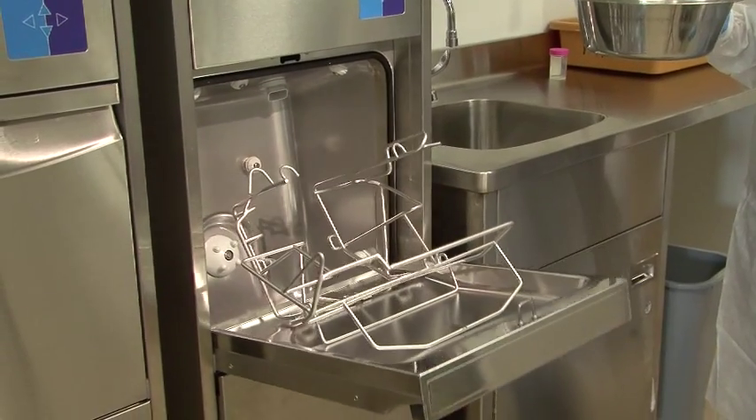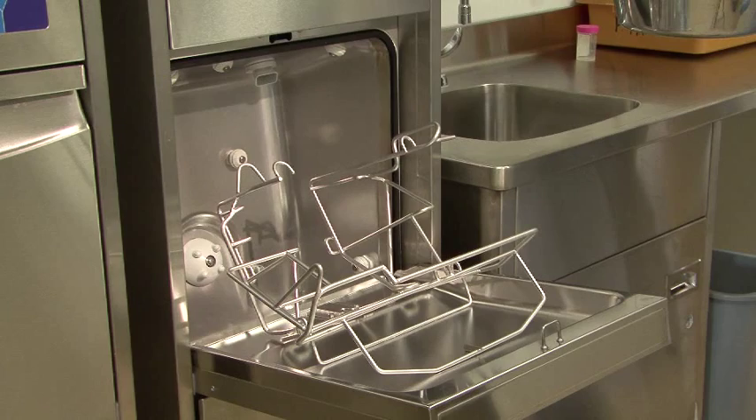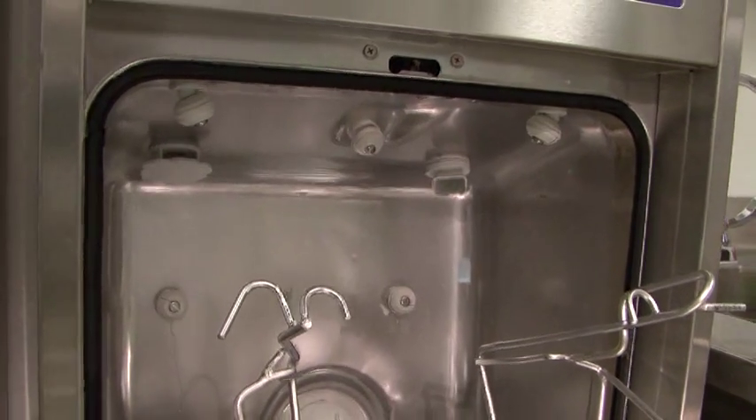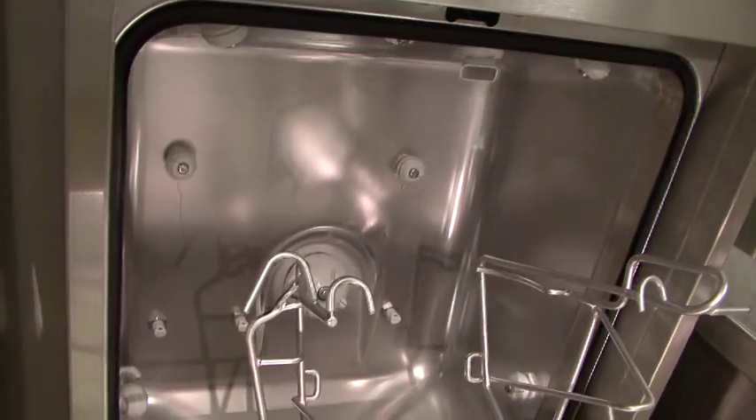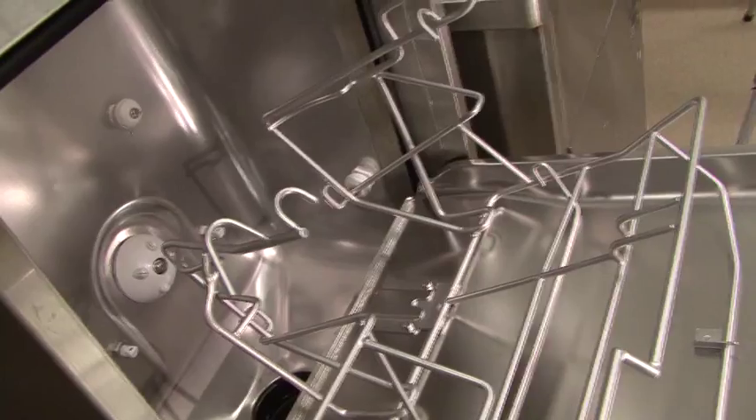Urinals, pots and bedpans must be loaded correctly for the machine to clean and disinfect them. The rack is custom designed to hold our devices properly and must be loaded the right way. Before loading, look inside the wash chamber to make sure it is empty and free of blockages.